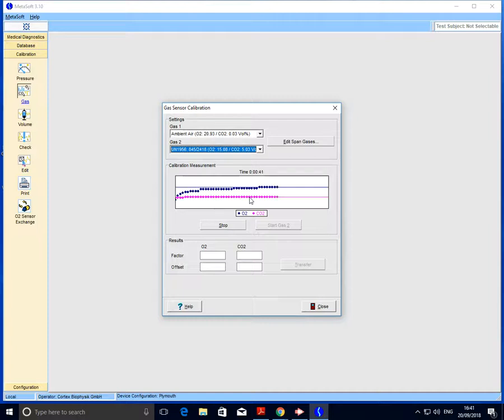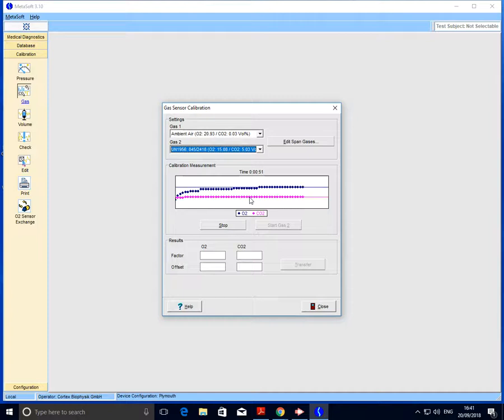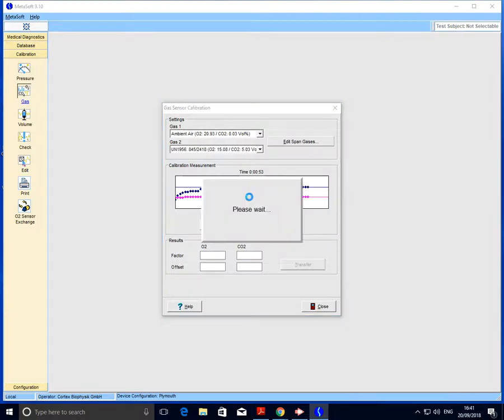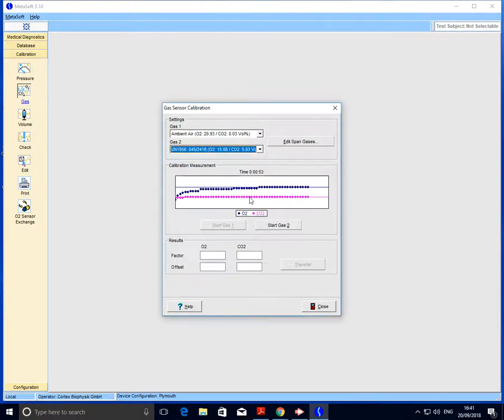Once we're happy we've got the correct canister, we can go ahead and screw on the demand regulator to the top. Once that's firmly screwed on, it's always worth just having a look at the gauge to make sure there's sufficient quantity of gas. If it's running slightly low, it's worth consulting a member of the technical staff and perhaps asking for a replacement canister.